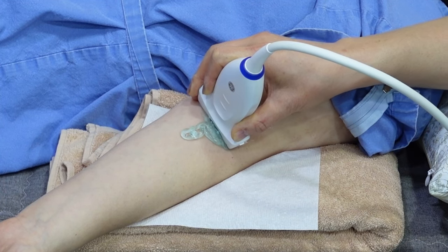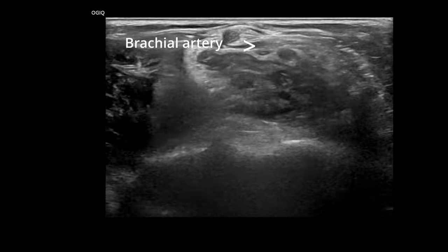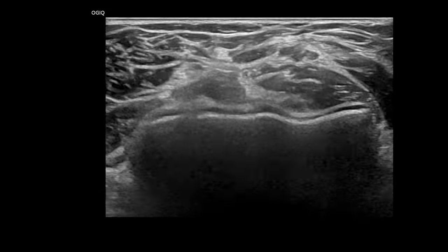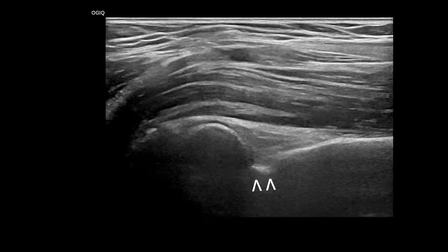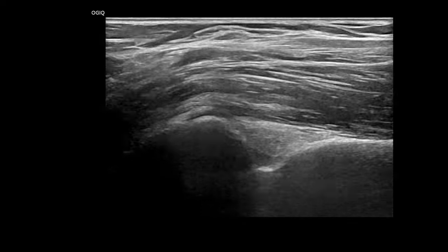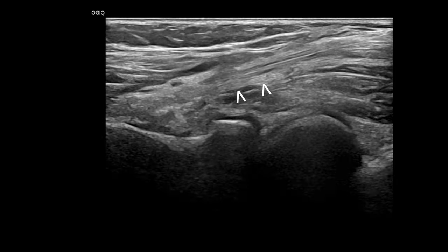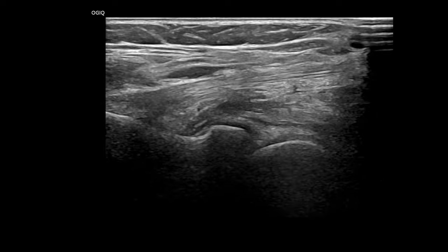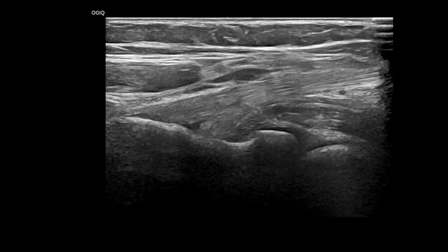In the transverse images of the supracondylar region, both the superficial biceps and the deep brachialis muscles are visible. Medial to these muscles, the brachial artery and the median nerve are located, with the nerve positioned medially to the artery. For diagnosing arthritic effusion, locating the coronoid fossa and assessing the amount of fluid in the deep space is useful. The coronoid fossa appears as a concavity on the anterior surface of the humerus, typically filled with the anterior fat pad. The distal biceps tendon is evaluated in both transverse and longitudinal planes, starting more proximally at the musculotendinous junction and following the tendon distally while the forearm remains in maximal supination.